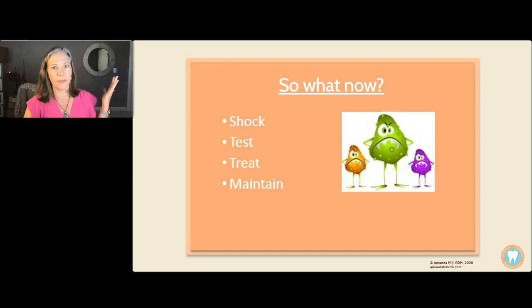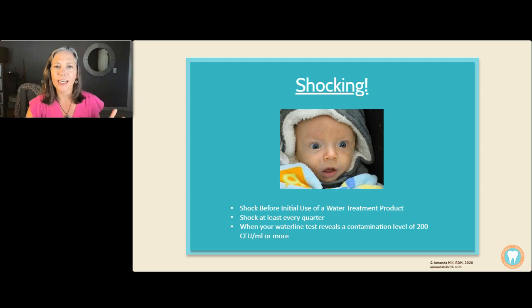So what do we have to do? How do we take care of it? You know why, right? You got it. You're convinced. You're like, all right, Amanda, I'm going to do this. How do I take care of this? We have to shock, test, treat, and maintain. So shocking, what is shocking? Shocking is using a really strong disinfectant to really rid our dental unit water lines of any biofilm.